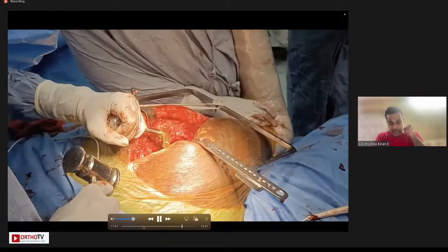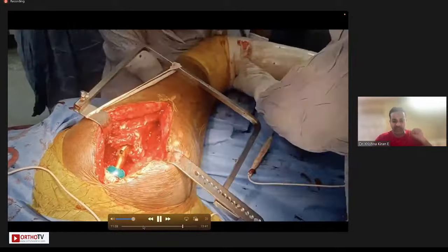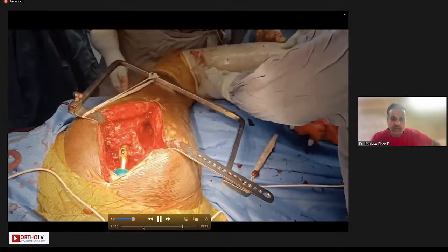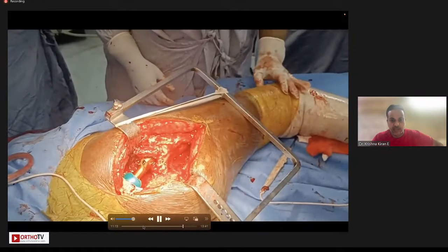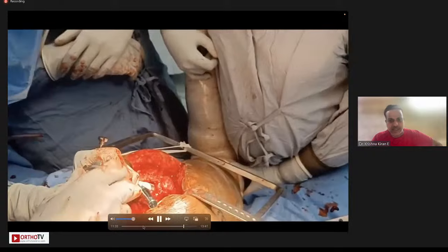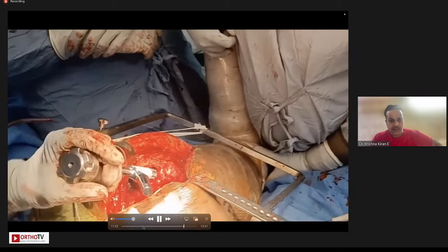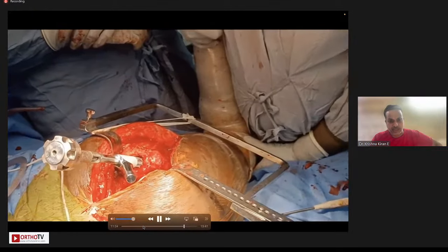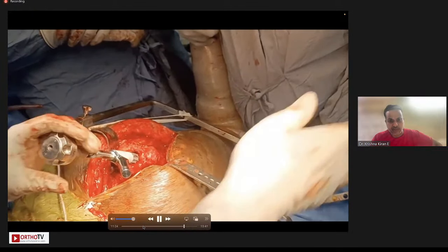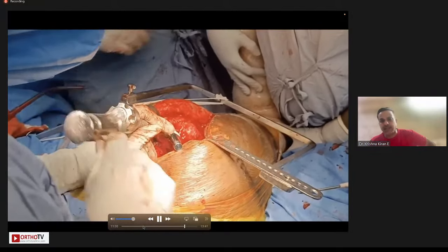Once the implant is stable, there is no axial instability, there is no interface mobility, and there is rotational stability. So these three factors we have to look at. Then we do your trial reduction, sleeping position, flexion adduction, internal rotation, and then finally you use the real implant in the correct version, and typically it goes in. You can see the proximal part is HA coated, and you can see it will not go beyond the line which was marked for the correct reduction for this patient.